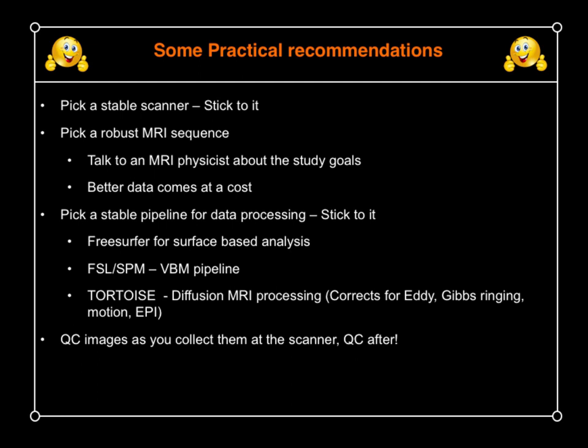I would also recommend QCing images as you collect them at the scanner. You can see these images popping up in real-time reconstruction, so it's useful to keep an eye on it. If you find some sort of artifact, sneak in another 5-minute scan and get the data, because once the subject leaves, all bets are off, right? So might as well do it while you're there.